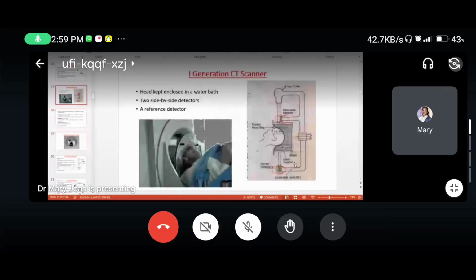Go back to that. So here you can see X-rays are coming from here. So the X-rays start interacting with the medium from here. From here it is getting attenuated. So this acts as an additional layer of skin or tissue around the head. So that is the meaning of bolus over here. So X-ray attenuation started here and it didn't stop here. It further gets attenuated.